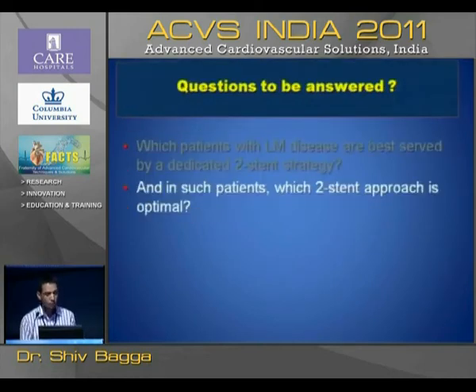The second question was which two-stent approach to choose from. As shown by Dr. Haridas, we really don't have any evidence base on which strategy to choose from. But we do have some pilot studies like the DK crush study which has shown actually that DK crush stenting may be superior to the conventional crush. Although we have data from the Nordic Bifurcation 2 showing superiority of culotte, but the drawback was the final kissing balloon was done lesser in the crush stenting group.